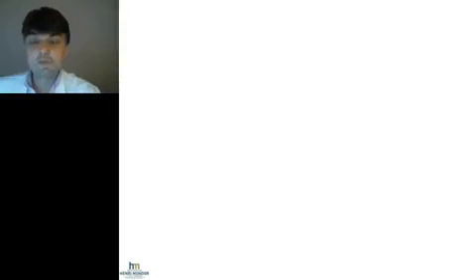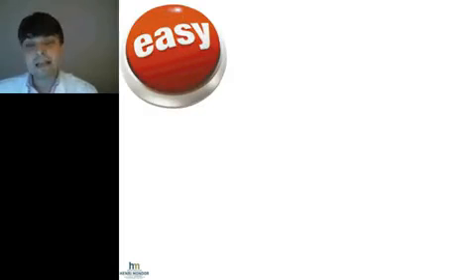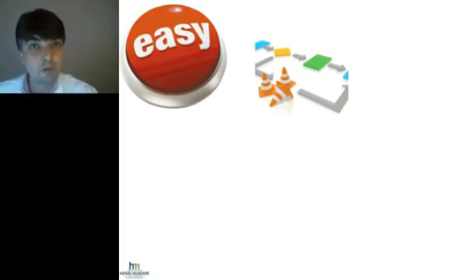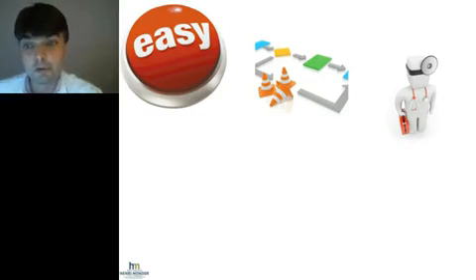So let's move on. How to put that in clinical practice? Well, we have to show it's easy, and we'll see how it is easy to put in clinical practice. The second thing is it has to integrate with our usual workflow. There's no way we can deal with 40 patients a day and have different workflows whether we use spectral imaging or not. So we have to have exactly the same workflow that we used to have in polychromatic images. And of course, last but not least, it has to have a clinical benefit, because there's no use in making any innovation if there's no clinical benefit of dealing with those innovations.